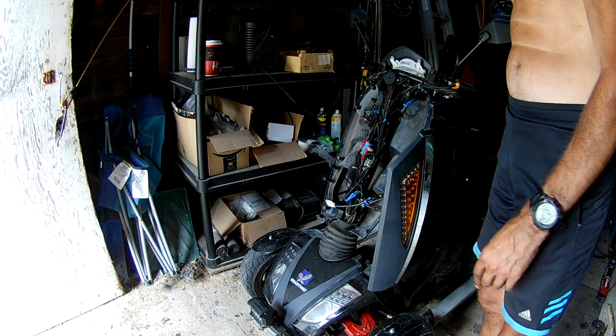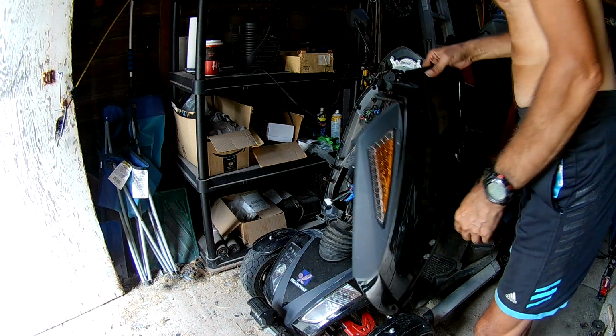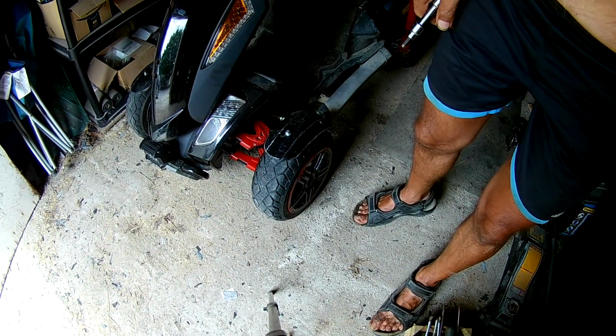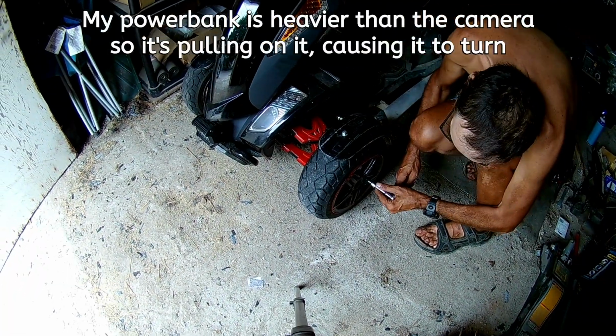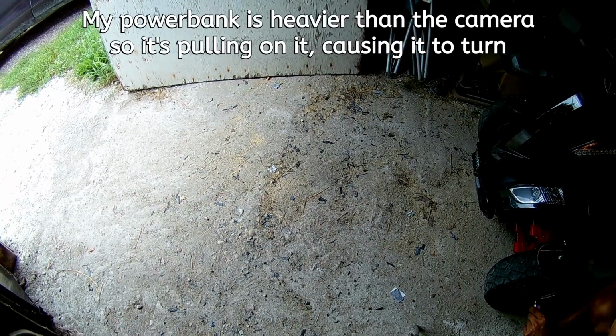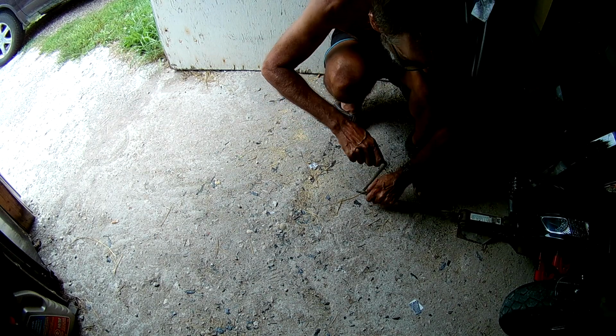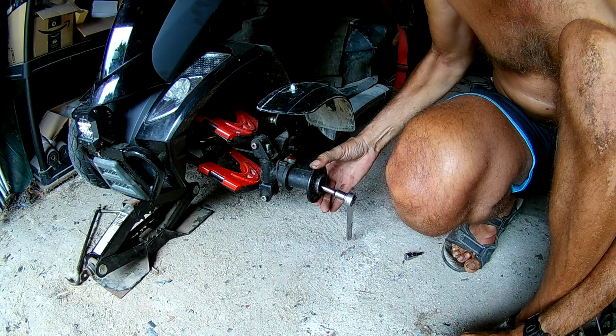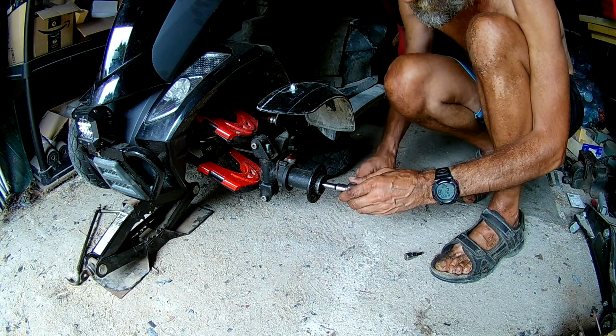Which means I got to take the wheel off. Pain in the ass, but at least it's easy to do. Apparently the camera turned off. I have no idea what you missed there, but I got the wheel off, and I'm going to take a look and find out why this is so loose. I'm here, might as well do it right.